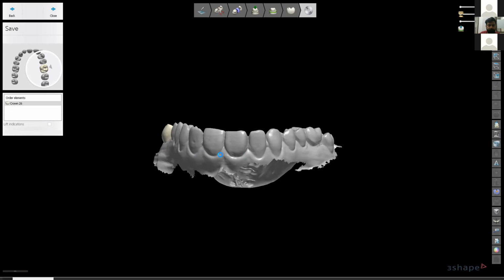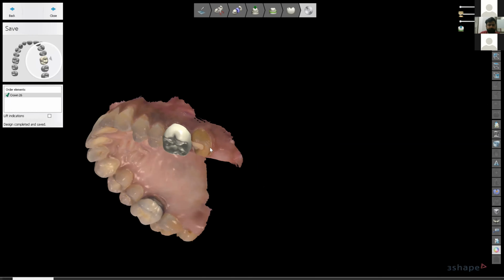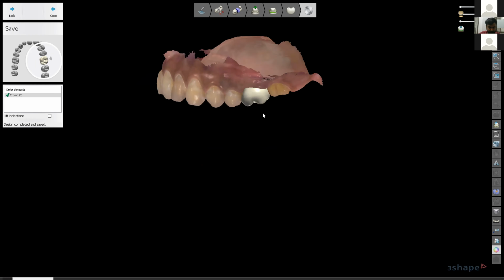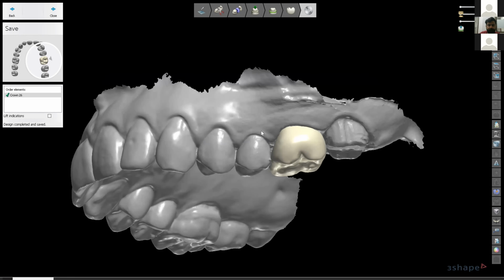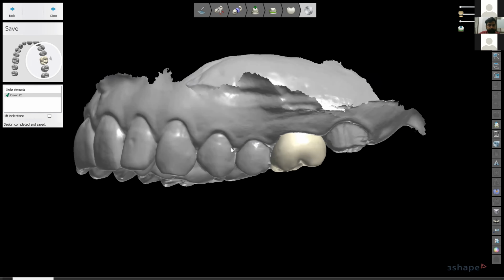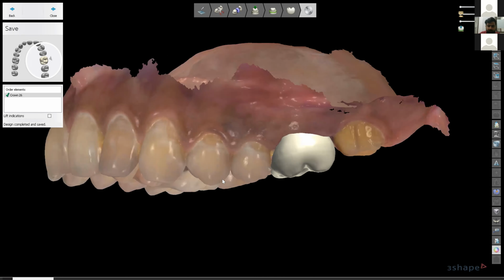One more thing. If the model is scanned using a lab scanner, the color is lost. Yes. So what do the labs want now? A picture using a mobile phone, or a shade card, or shade measurement, for the color of the tooth? For the shade measurement, right, ma'am?